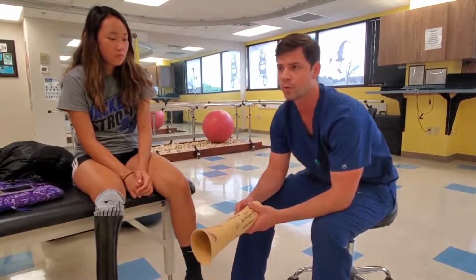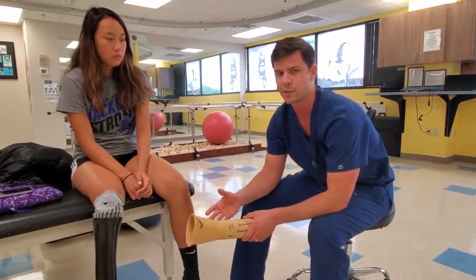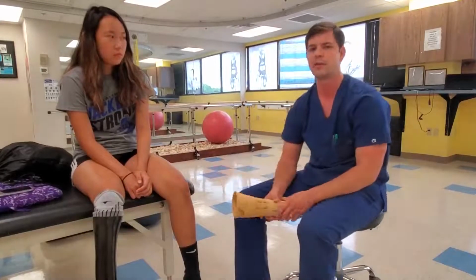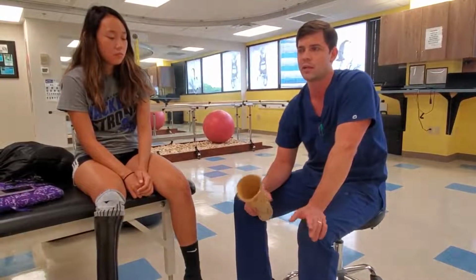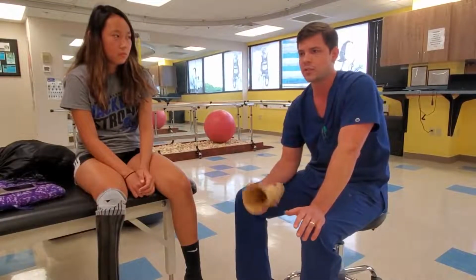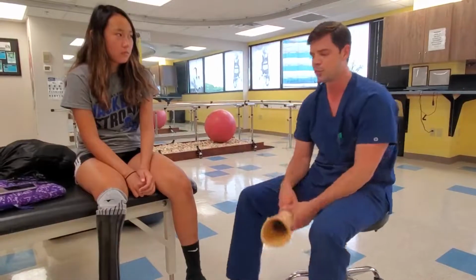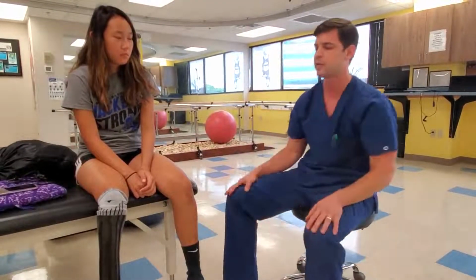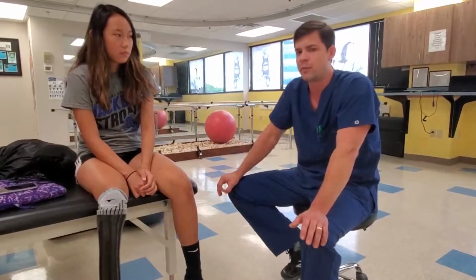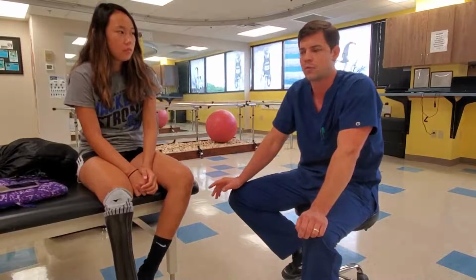And so what we determined is, yes, she has grown in volume about 2 centimeters, and yes, she has gained some weight, and the socket was no longer hitting her in the areas that we anticipated the socket to hit when it was fitting about a year ago. And because she's very active, she's involved in volleyball, she runs track. I don't know if she's doing basketball anymore right now, but she's a very, very active prosthetic user. And so due to her activity, we really didn't want to have any more setbacks with chronic skin breakdown and skin irritation in the back end of her leg.